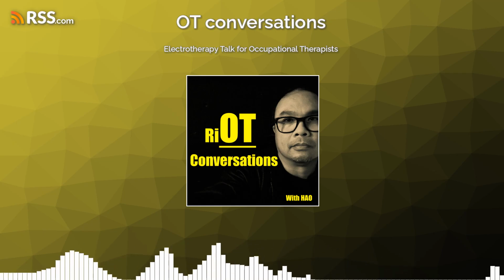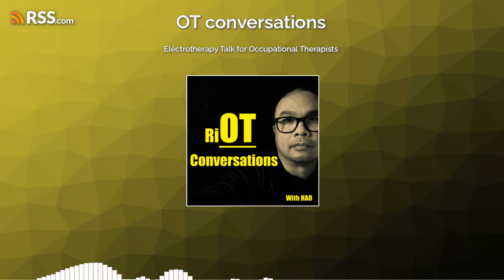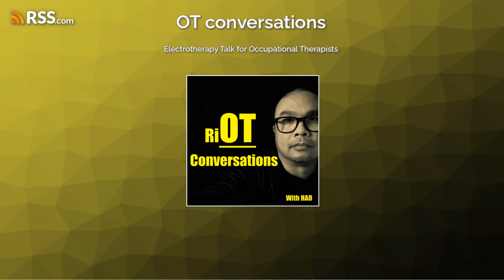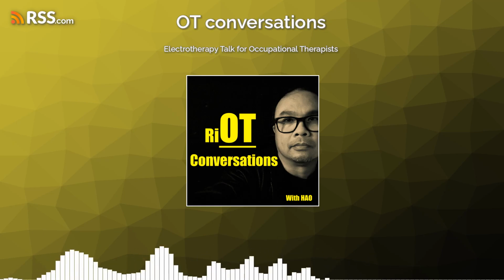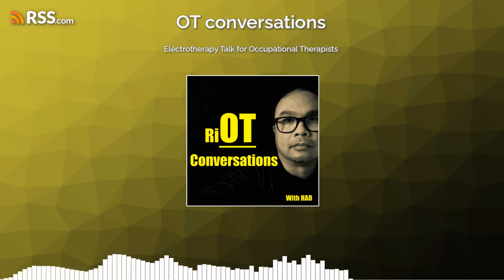Another one would be it's used for neurological conditions where it improves the function in individuals with multiple sclerosis, Parkinson's disease, cerebral palsy, stroke. Again, a staple adjunctive therapy intervention.